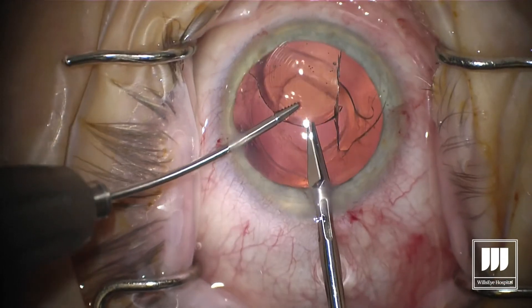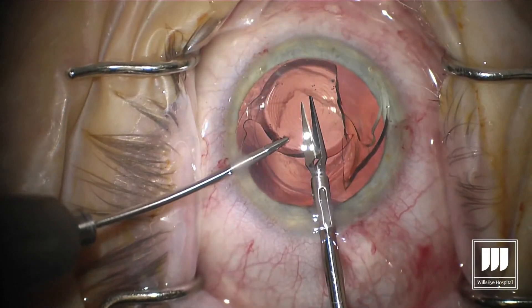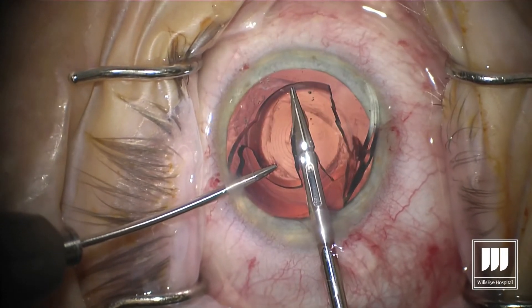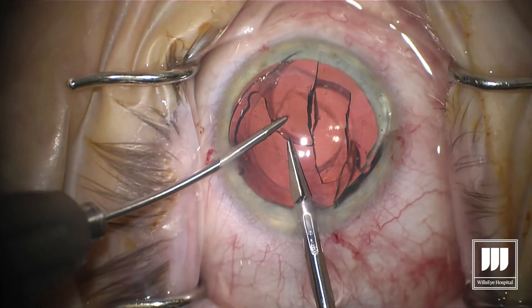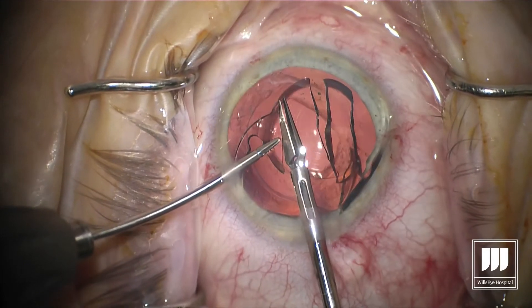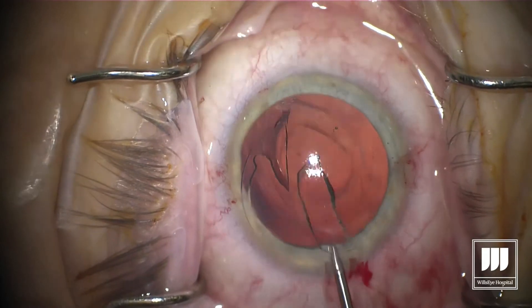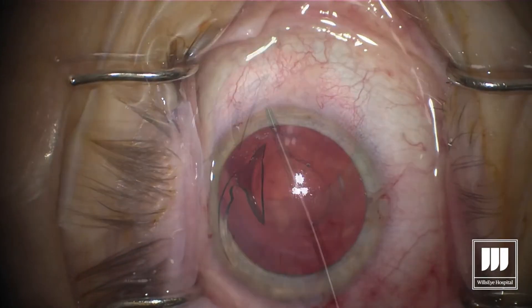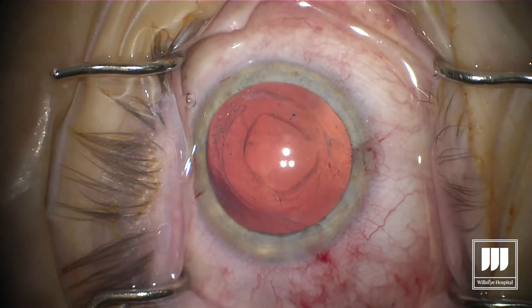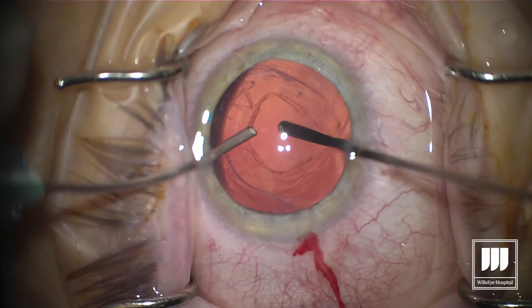People often ask: is that implant going to fall into the eye? Are you worried about leaving pieces? There's so much OVD in the eye that those pieces are sitting in a viscoelastic jello. To date I've never lost a piece of IOL to the vitreous when there was viscoelastic — but if it's all BSS or saline, they'll fall right back, so be careful. Taking pieces out through the temporal incision — grab by the very end. I hate it when people bring the haptic out backwards; it traumatizes the wound and the attending.